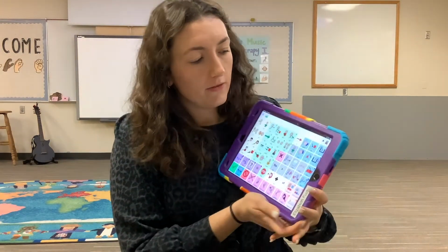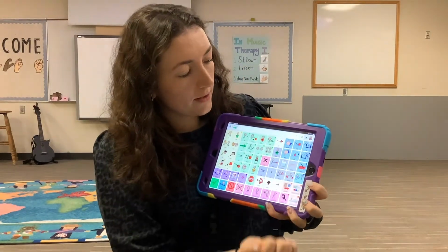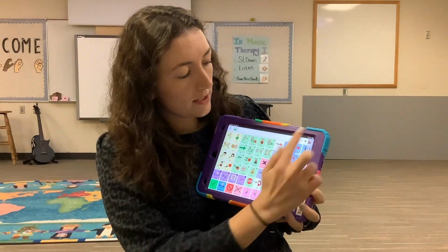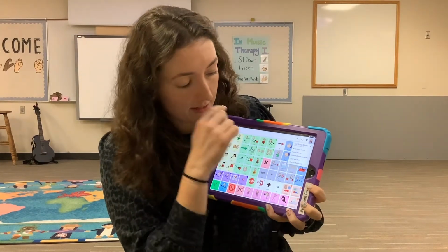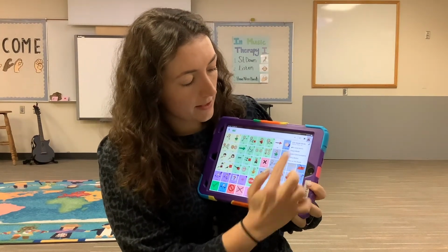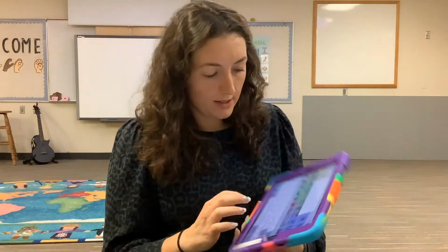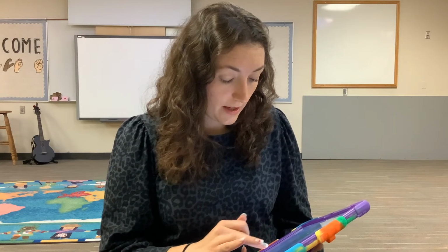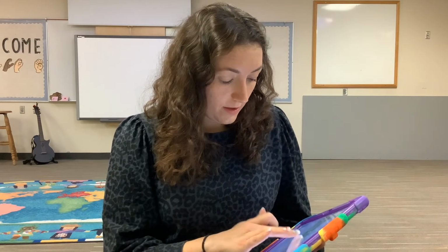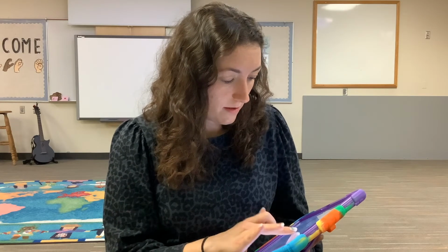And so if you go up to, in CoughDrop, there's a little picture of your student or just an image, and it comes up with a list, and it says find a button. So if I want to talk about, like, let's see what animals we have. An octopus. Do we have that on here?